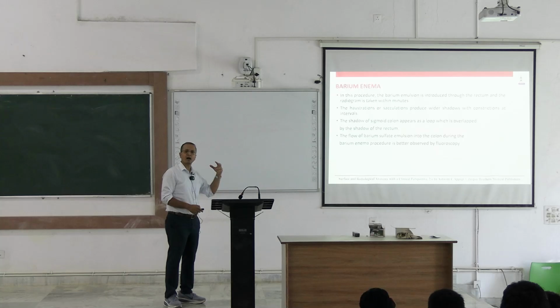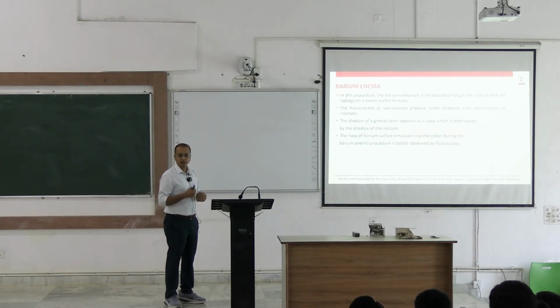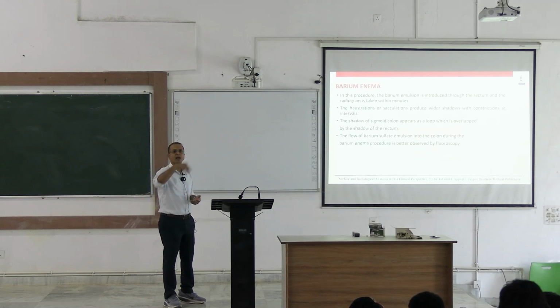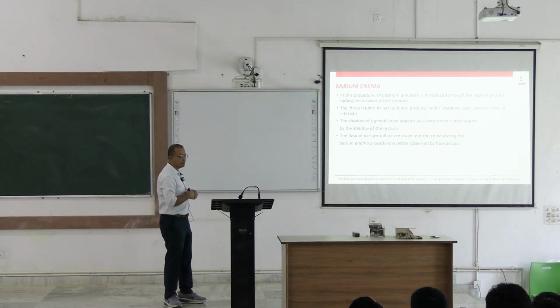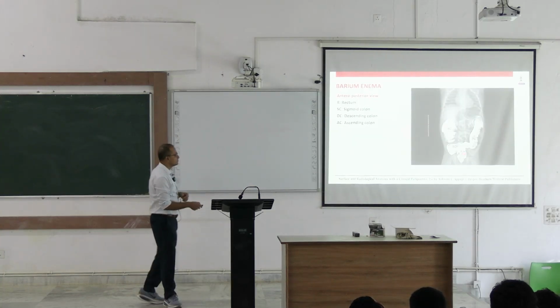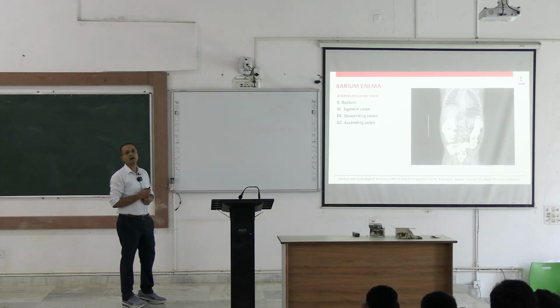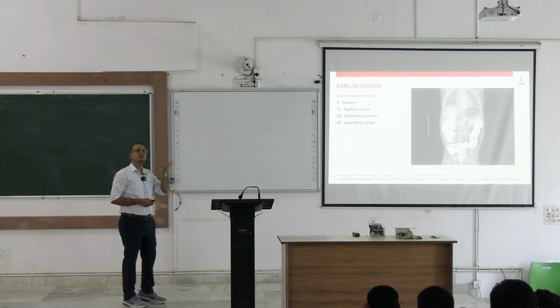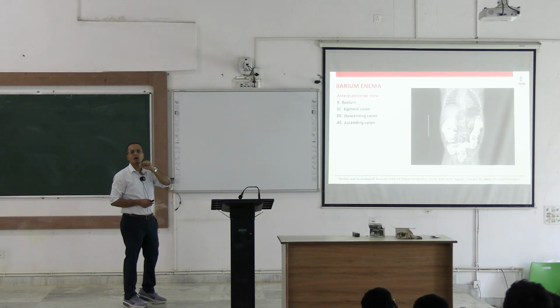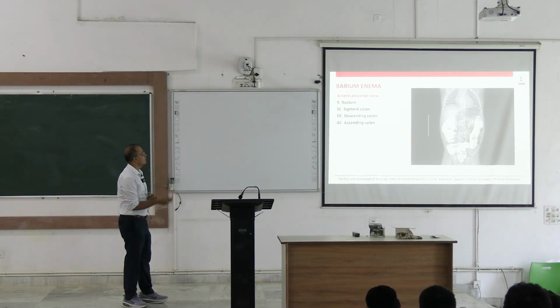Now, if you are giving the dye not by mouth but through the rectum, we call it a barium enema. We give the same barium salt through the anus, then wait for some time or push it through the pipes and visualize from the retrograde direction: from the rectum, sigmoid colon, descending colon, transverse colon, up to the cecum. This area we call barium enema. So it is the same barium salt but given through a different route, to visualize the lower part of the abdomen properly.